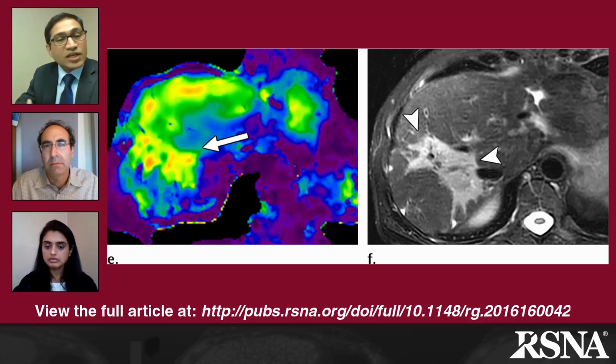But we are seeing more and more of these stiffness patterns. These patterns can also change with treatment. And we have to gain more experience to see how this stiffness pattern changes with any other particular disease. But in general, MR elastography gives you a snapshot of what is happening, a cross-sectional view in the liver, showing which part of the liver is affected, and which part is more affected than the others. And this may be useful for evaluation of treatment or for response assessment.